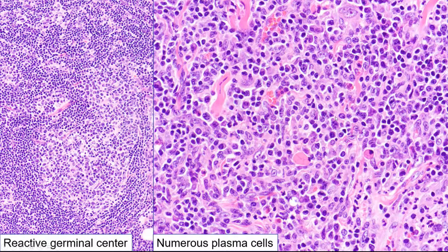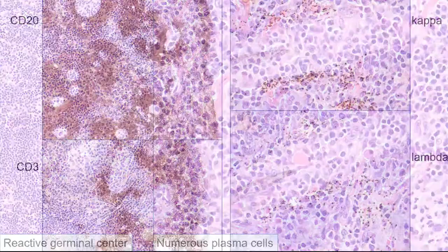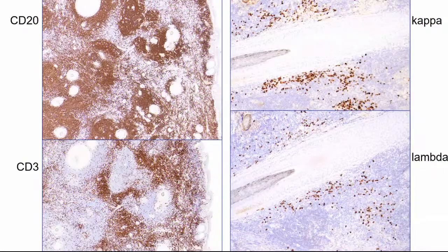And then in other areas of the infiltrate, in addition to small lymphocytes, there's many plasma cells. You can see plasma cells all over the place. Some of them have the appearance of Mott cells with multiple globules of cytoplasmic immunoglobulin within the cytoplasm. And so a lot of lymphocytes, plasma cells, germinal centers, big lesion. Could it be MALT lymphoma?